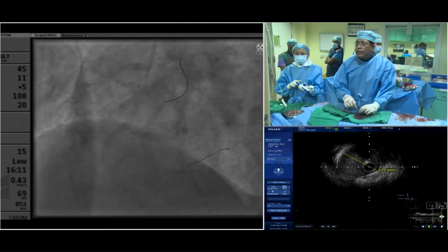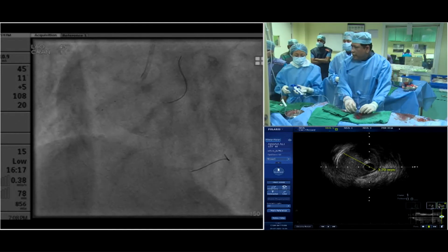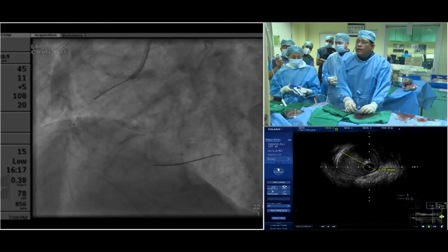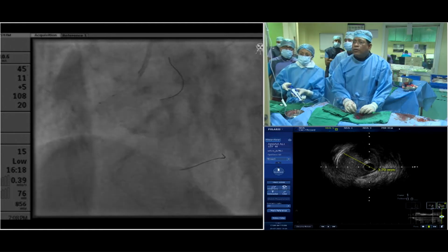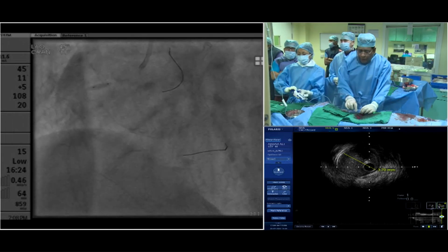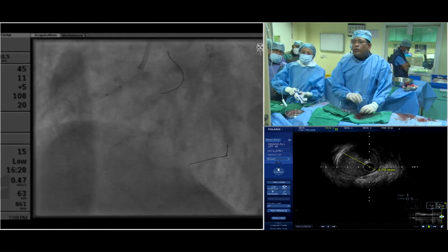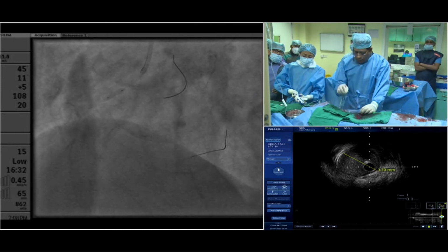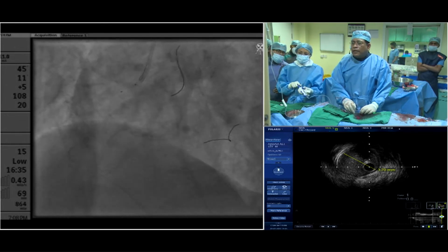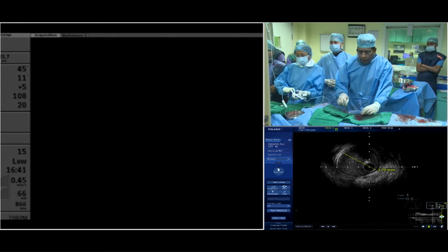Okay, we'll dilate here. I think this is here only. Show me the scene again. Previous one scene where the disease, where landing zone was there. This is landing zone, huh? Okay, so we'll go here. Okay, go. 12. Down. So there is one important aspect is when go again. 16. Down. So if in a 3.5 vessel, if you are going with a 3 balloon, it doesn't generally cause injury. So go again. So you should be very relaxed with that. Down.